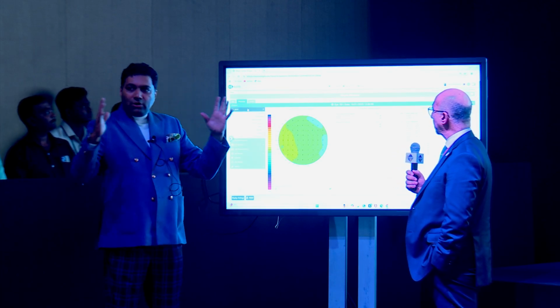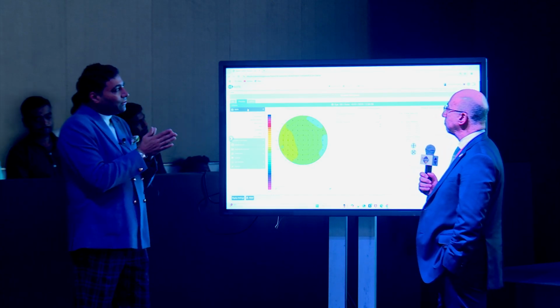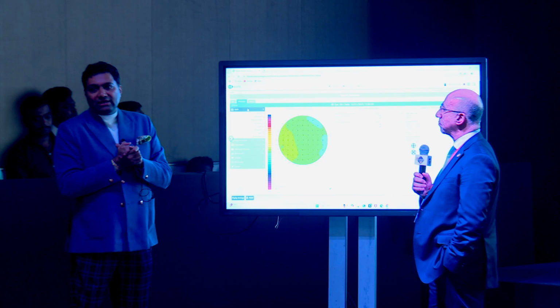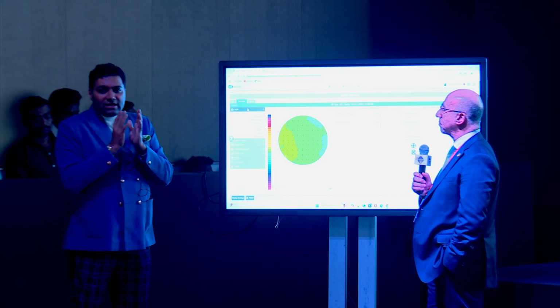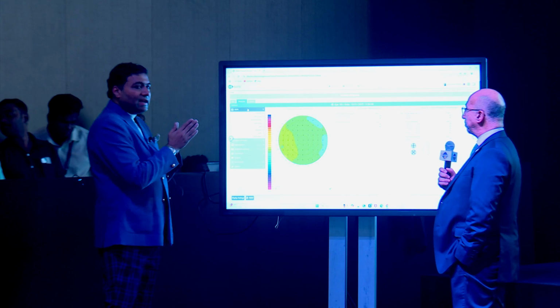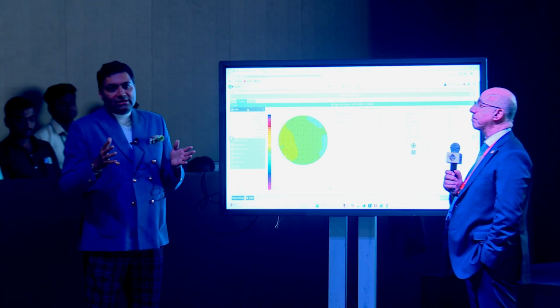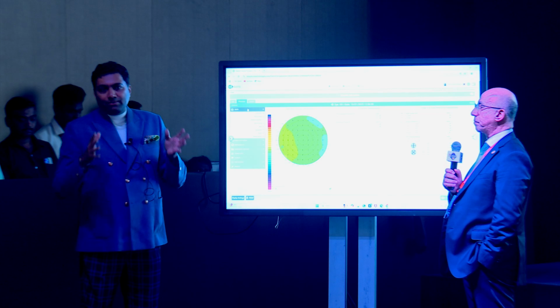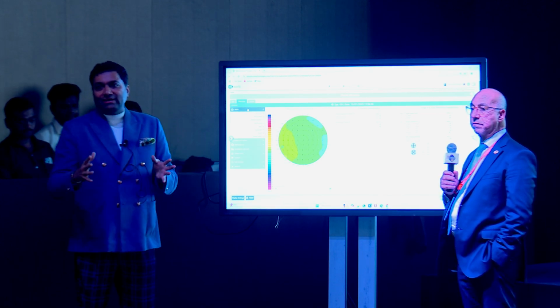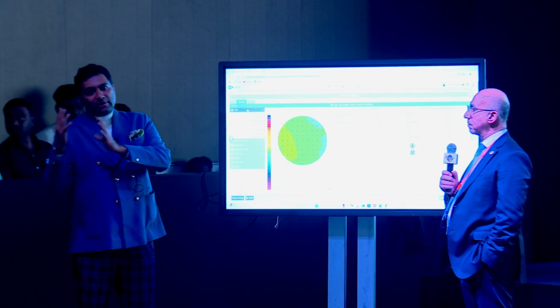So now you have all these parameters here. Technically, when I saw this, I said, okay, a lot of machines can do this. Of course, there may be a challenge in the repeatability, but what is the real difference is that it has a complete system to look at the pupillometry. And the pupillometry is probably the most important factor which makes the system work in a different way.